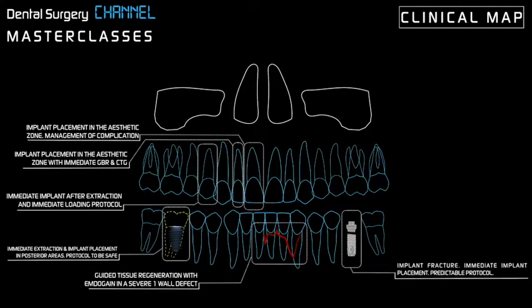More and more often, we're going to see implant fractures, especially on external hex abutments and platforms. So it's very important not only to be able to remove the implant, but there is a protocol and there is a clinical decision process and clinical management of those cases that we need to classify in order to be predictable. Do we trephine the implant? Are we going to be able to untorque the implant directly?